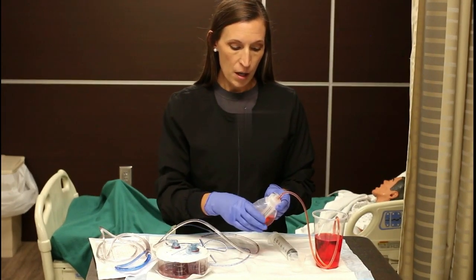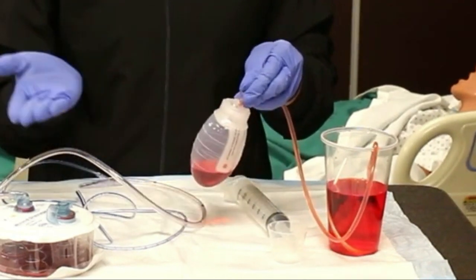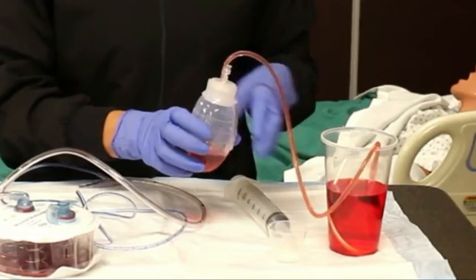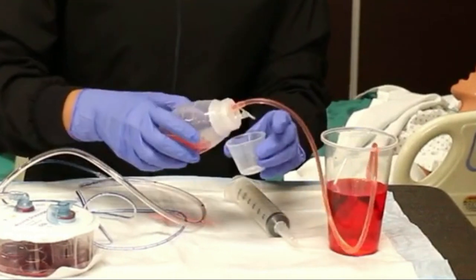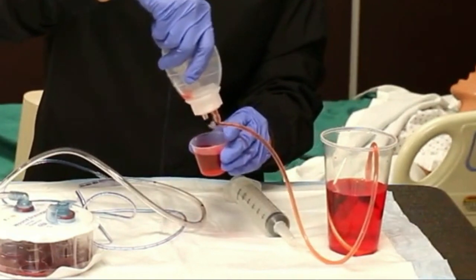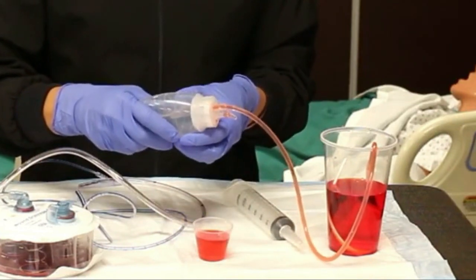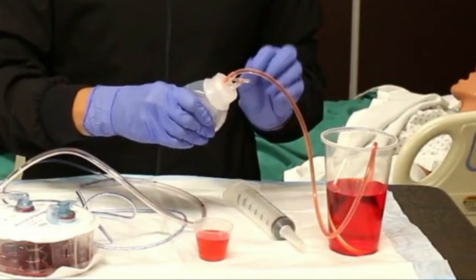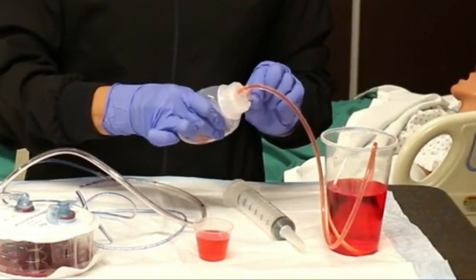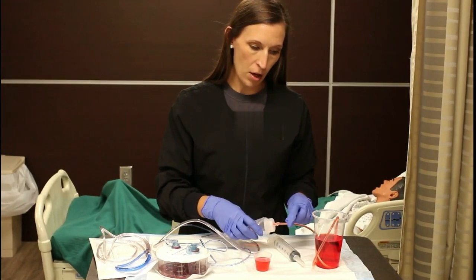To empty the JP drain, you just open it and it will inflate. Don't use the drain itself to measure — it's not quite accurate and it's hard to tell. You'll use a measuring cup device and squirt it out to measure it. It's usually measured once a shift and it goes into intake and output charting. Then you'll wipe it off, plug it, activate your suction, plug it back in, and make sure that it's connected and not hanging off the patient.